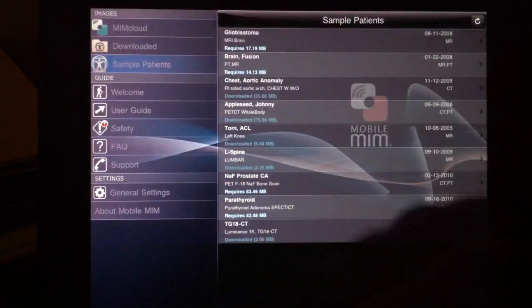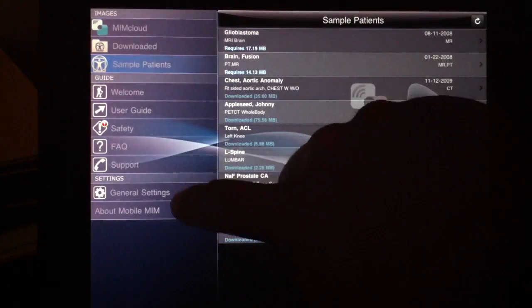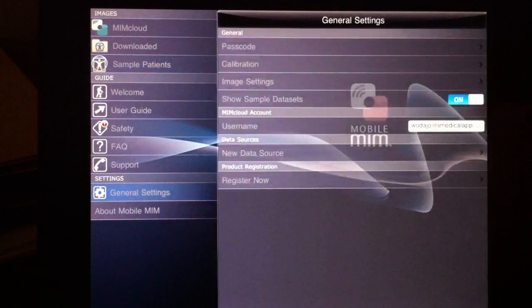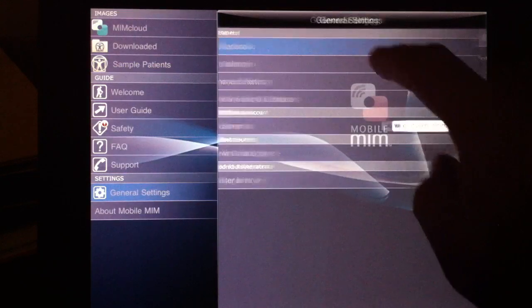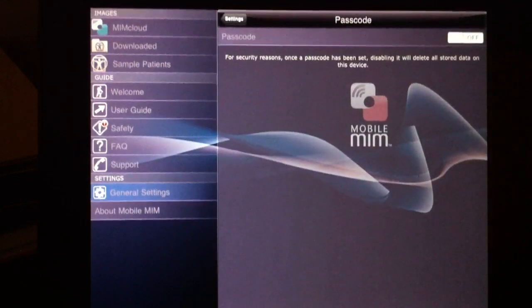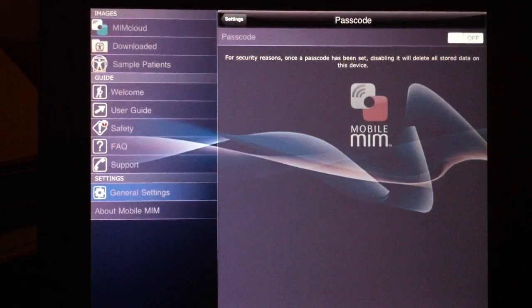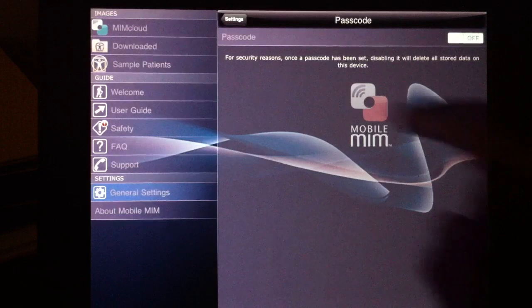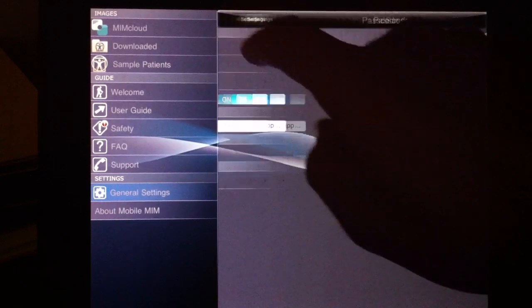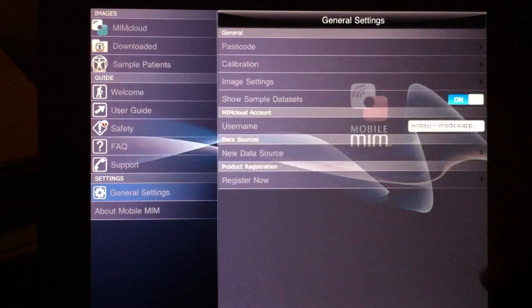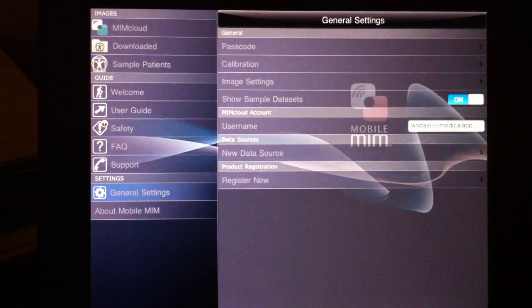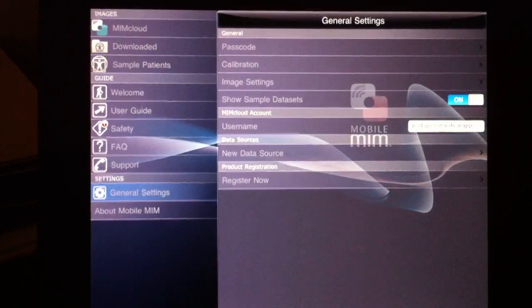Lastly, if you go back to the settings, you can set a passcode to prevent unauthorized use. The welcome and user guide are available here as well. And that's the end of this demonstration.